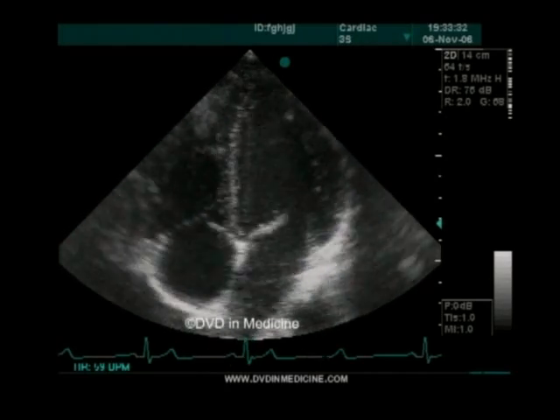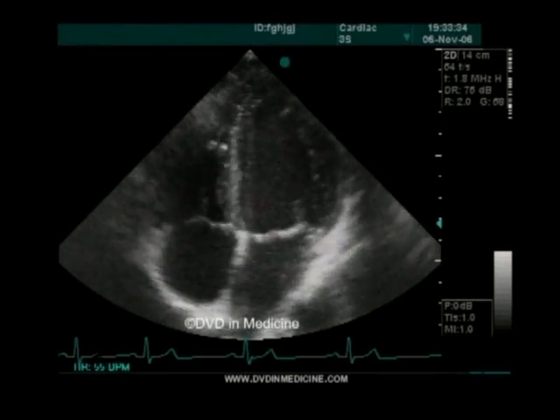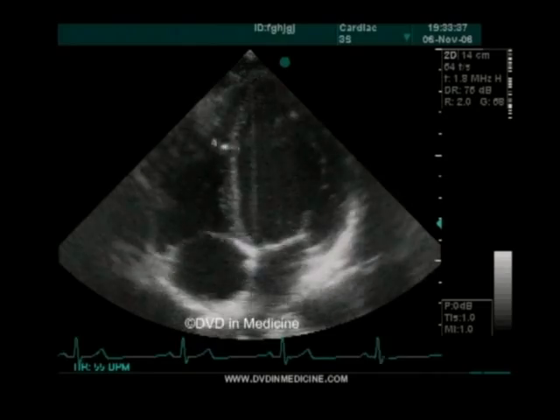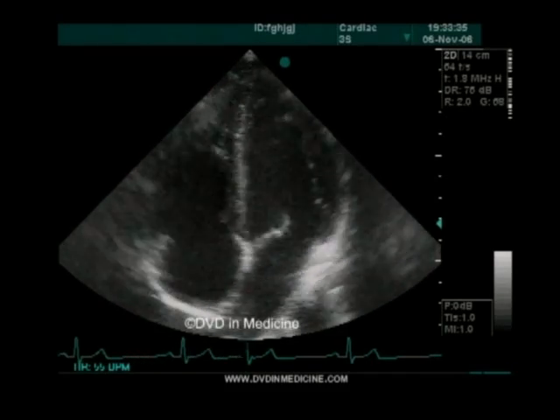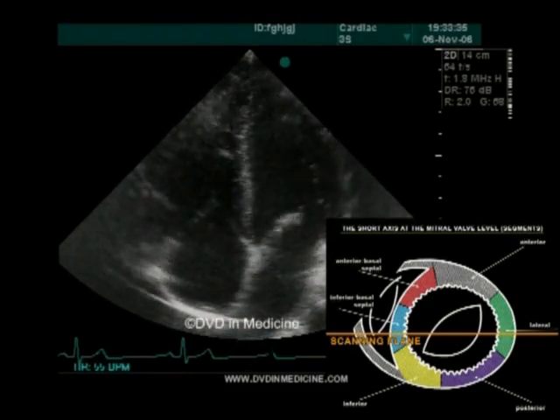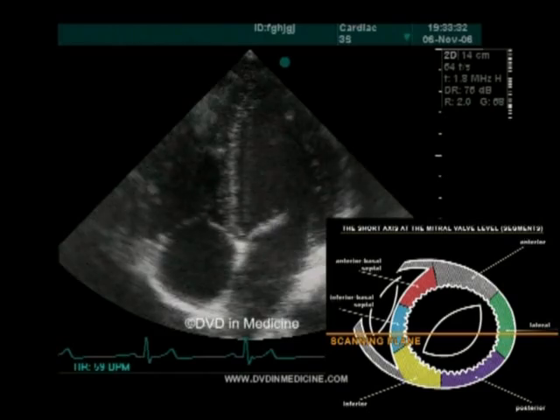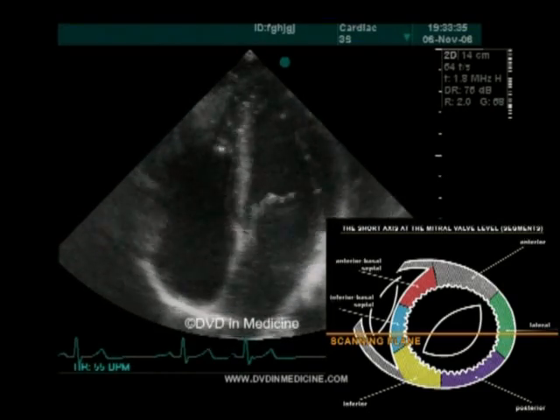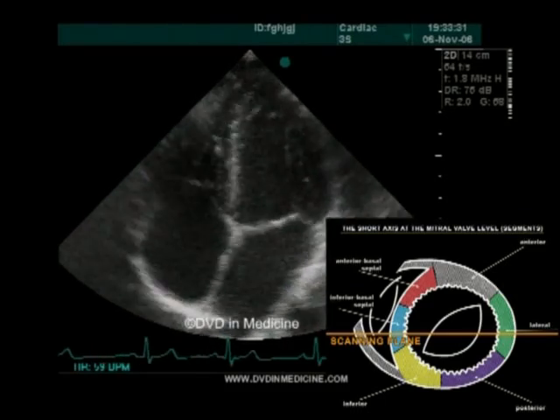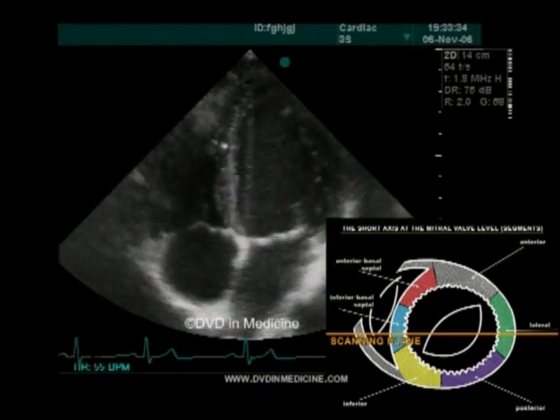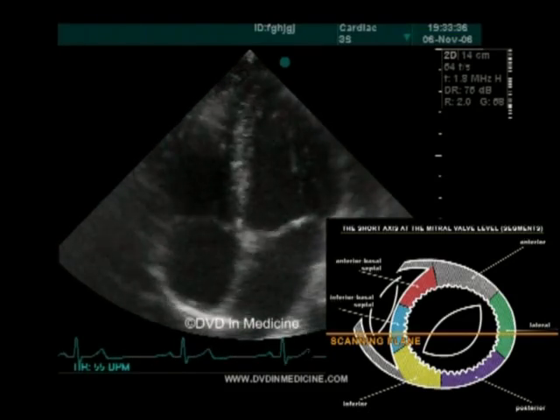By using the apical approach, one gets the impression that the central part of the interatrial septum is absent. In this case, one should use the subcostal approach for optimal visualization of the interatrial septum. In an apical four-chamber examination, the scanning plane crosses the inferior segment of the interventricular septum — it is important to keep this in mind when assessing the patient with coronary heart disease. In typical cases, the inferior segment of the interventricular septum receives blood flow from the right coronary artery or the circumflex artery, as opposed to other segments of the interventricular septum, which receive blood from the left descending coronary artery.